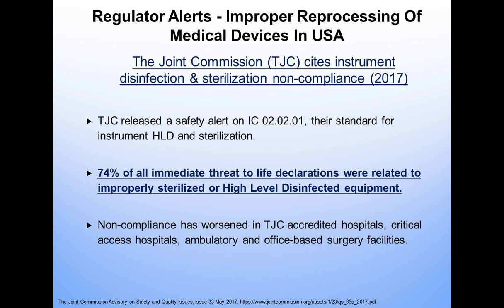So what's happening in the U.S.? Well, there's the Joint Commission in the U.S. A lot of people have heard about AAMI and their accreditation processes through the Joint Commission. There has been some non-compliance with disinfection and sterilization of reusable instruments. They also released a safety alert on standards for instrument high-level disinfection and sterilization. And following that, they noticed that 74% of all immediate threat to life declarations were related to improperly sterilized or high-level disinfected equipment. Now, this could include other devices as well, but certainly ultrasound probes were included in that.